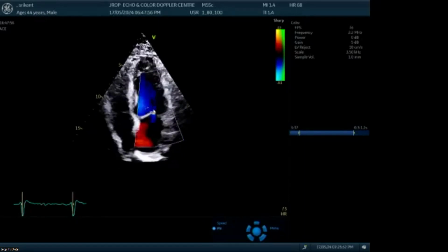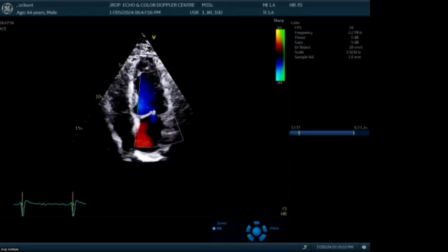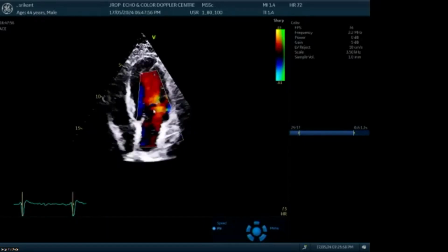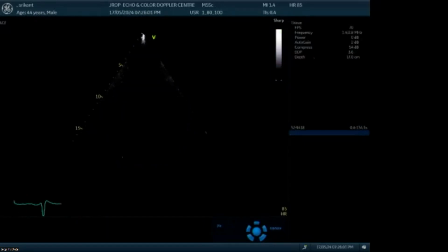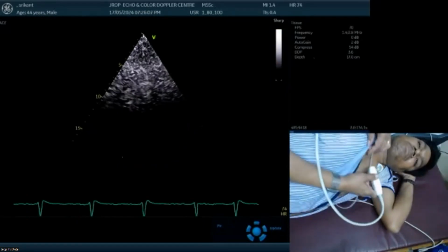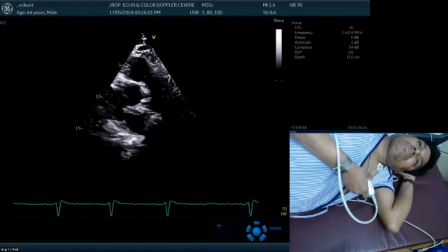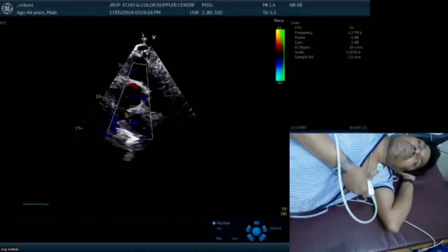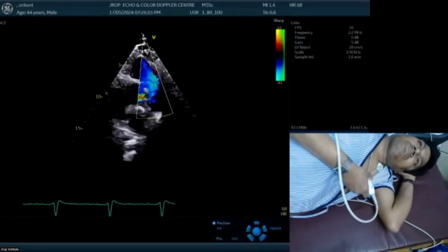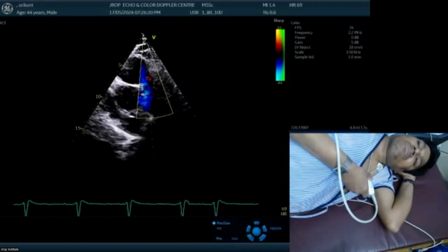Then go for a PR jet gradient, not TR. Let me try it in the subject. Good question. Try all 5 windows; it is very rare that you cannot get a PR jet gradient. Go to PR jet gradients. I've got a very trivial one. Let me try if I can get the PR gradients.